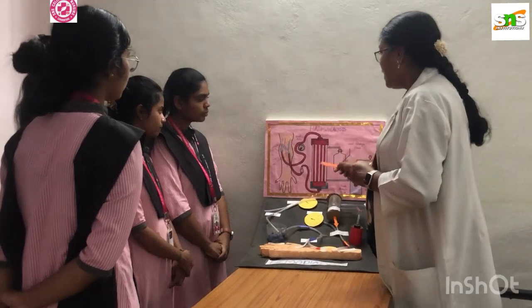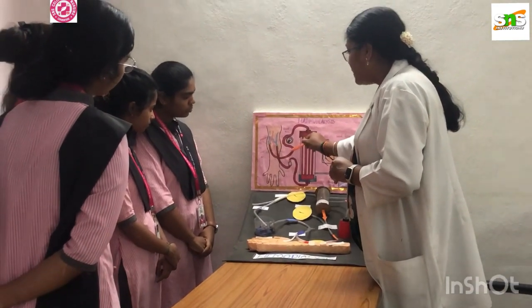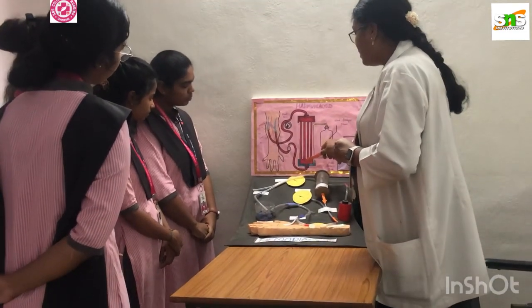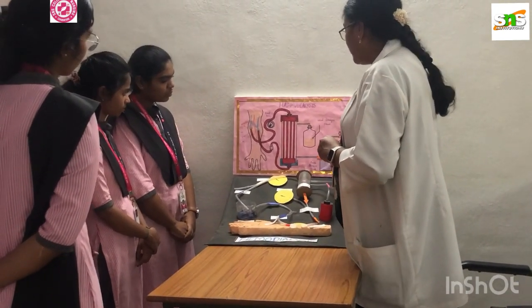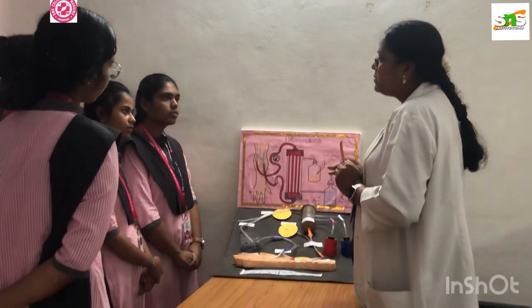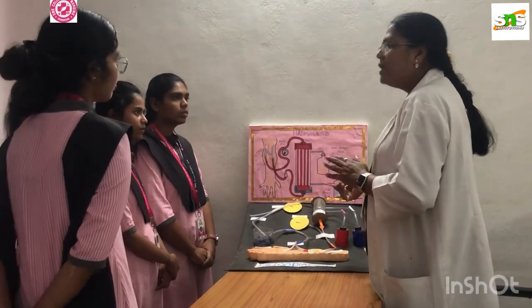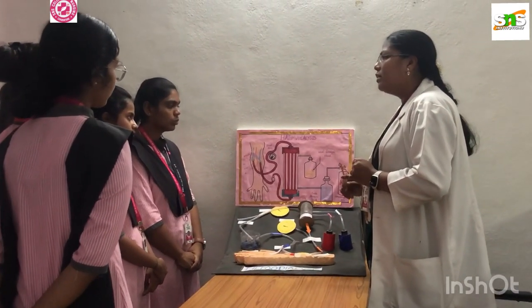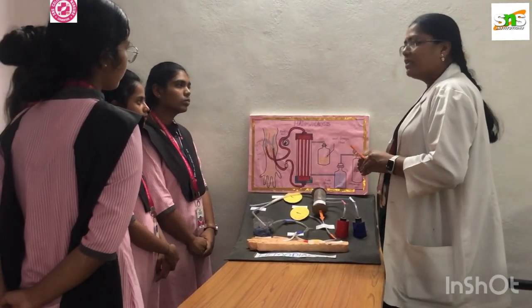In a quick recap, you can see a fistula. From the artery the blood is taken up and enters the dialyzer machine. The air trap, or air detector, is used, and the dialysate fluid is taken back into the machine and filtered. We have to make sure that the air does not enter the bloodstream at any cost. What happens if air enters the bloodstream? It will result in air embolism, especially when the patient is on a heart-lung machine or under the dialyzer machine. Another one is a plasmapheresis machine.